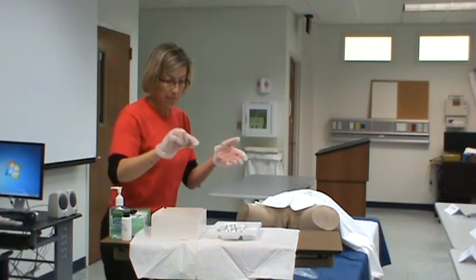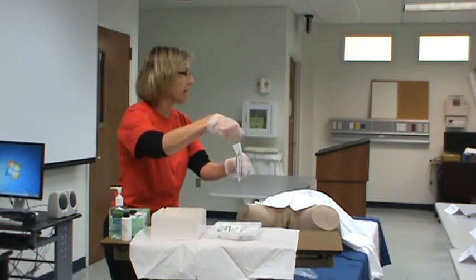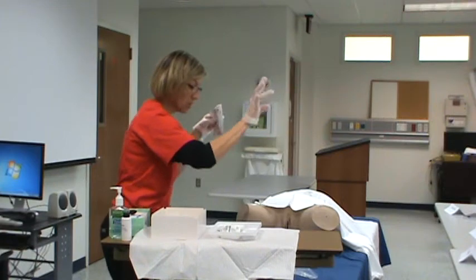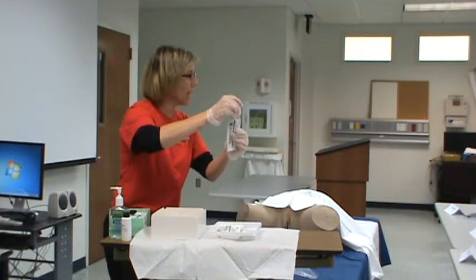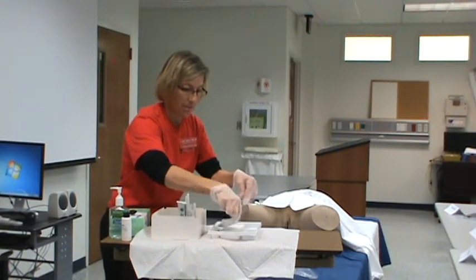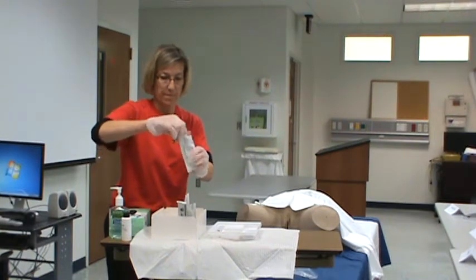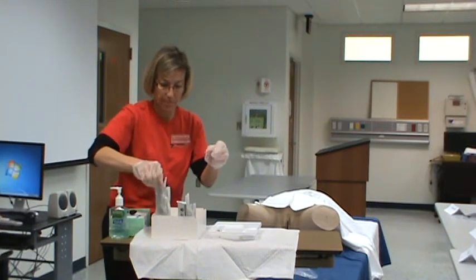All right, so now I am inspecting my kit. This particular kit, instead of the iodine and the cotton balls that you saw in the demo, has swab sticks. So, swab sticks, and I'm going to use my bag. And then you kind of lift them up to make sure that they're easier to get at for you. And then I stick them up in my box. And then I've got another one. I generally only use the 3, but I have them ready. I want to be a prepared nurse, so I'm going to have them ready.